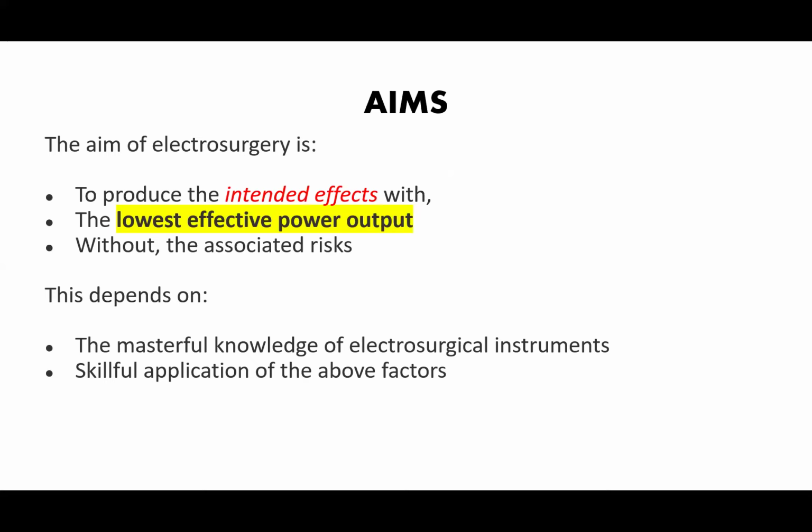Now, the aim of electrosurgery is, one, to produce the intended effects with the lowest effective power output without associated risk.